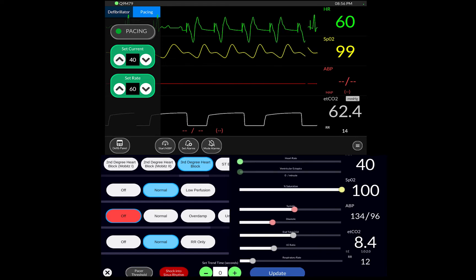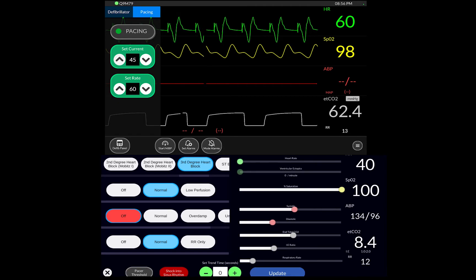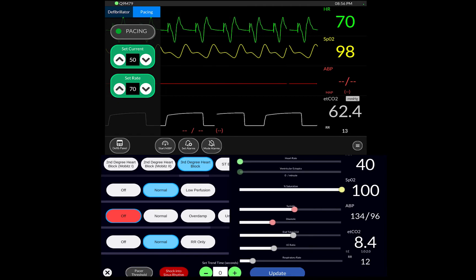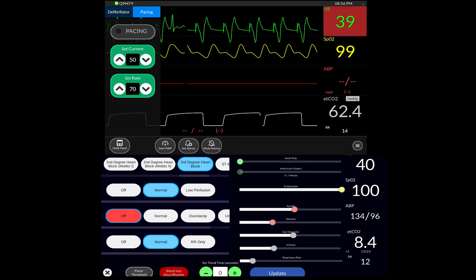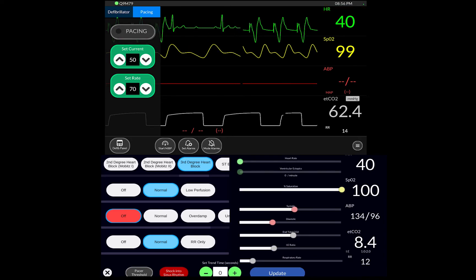You see? After every spike, we have a pacing. And then you can increase your current or increase your rate or whatever else you want to. And then you have it. So that is your pacing and your cardioversion. If I turn off pacing, it all goes back to normal.